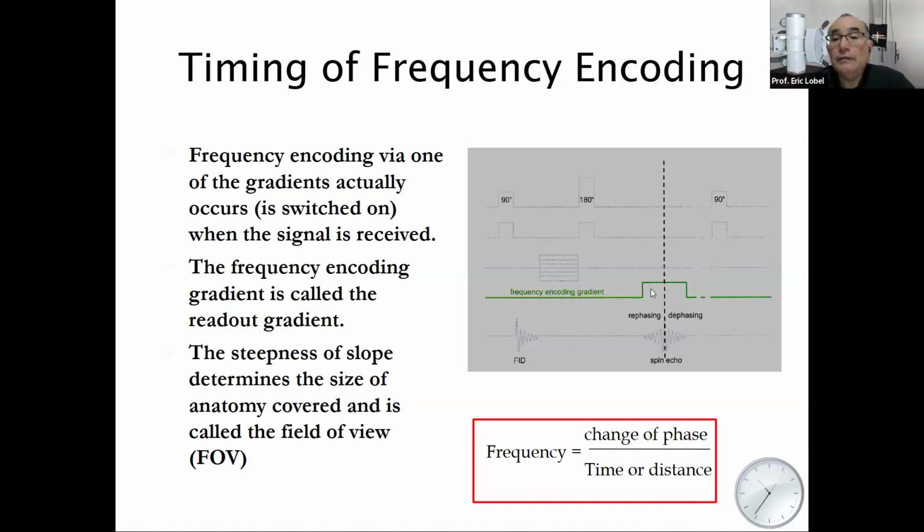Narrowing this in, if we turn this rectangle into a box, would be increasing the slope and getting a smaller slice, so to speak, a more narrow set of frequencies, right? And the frequencies towards the middle are higher, which is why our signal to noise goes up when we reduce this receiver bandwidth.